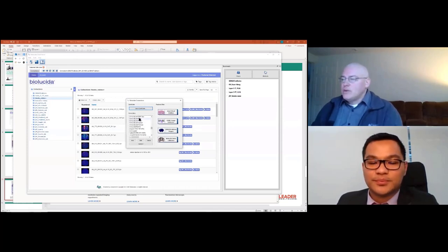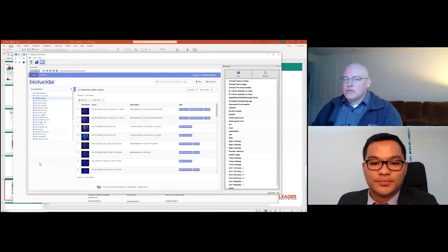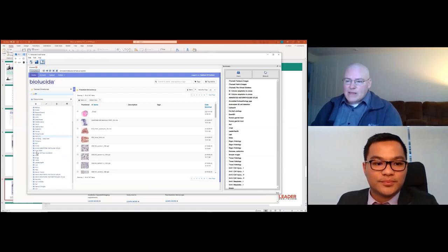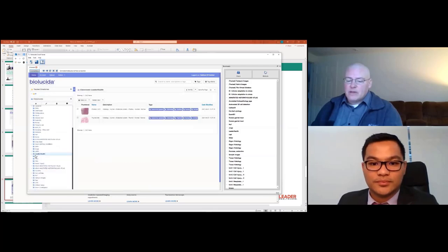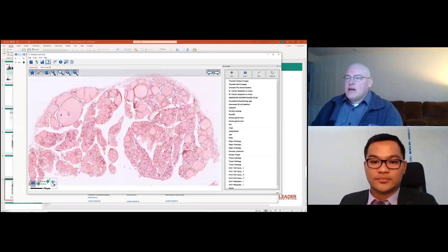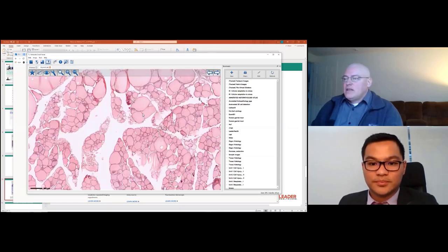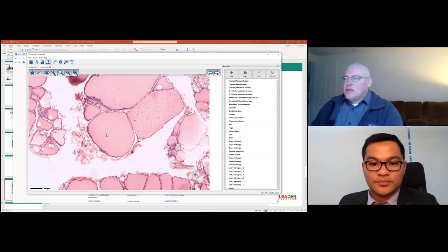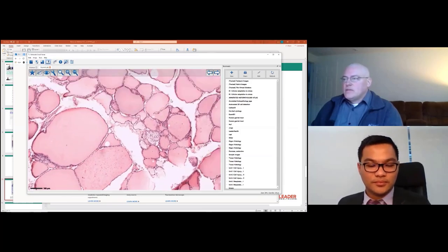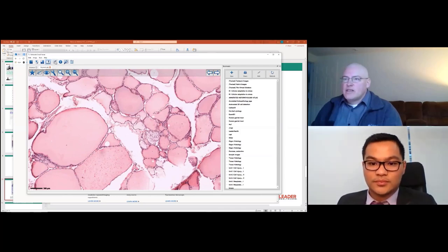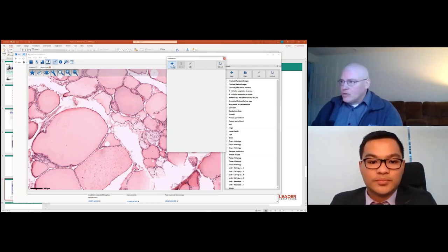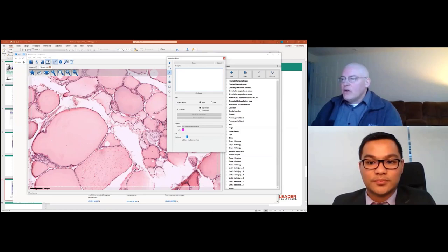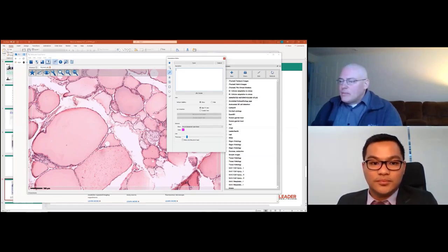Let's go back to the Leader Health collection and look at the thyroid slide to make some annotations. I'll click the hand-with-pencil icon to enter annotation mode. If you can draw in PowerPoint, you can pretty much draw in BioLucida. I'll draw an arrow and change its color. I can control how I want to show this — whether it shows when the student calls it up, just around the annotation, or at a specific zoom level. I'll use custom view, set it to the placement zoom level, call it 'Arrow one', and save.